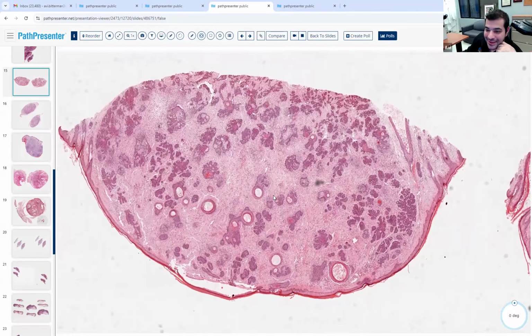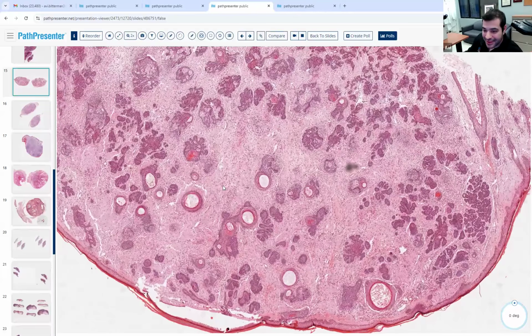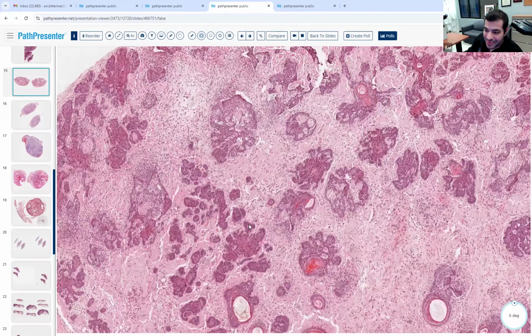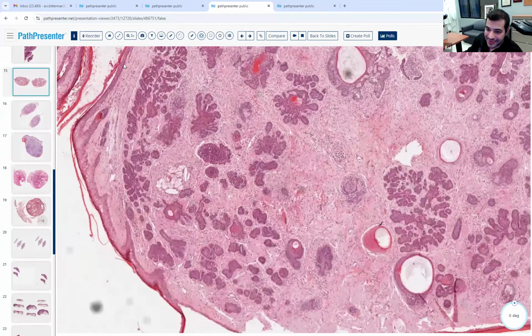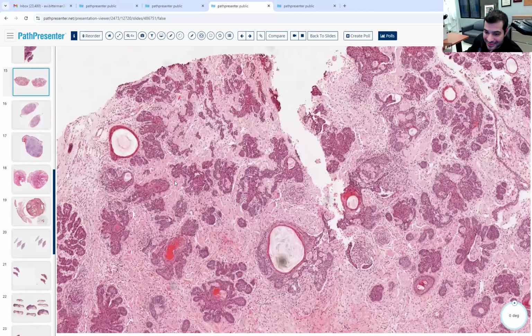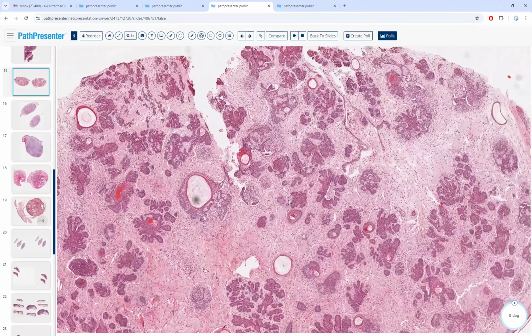What about this one, guys? Would you call this a paisley tie pattern? Well, I can see why you say not quite. I mean, this tumor has cysts and it's keratinizing, but it's more than just a paisley tie. Some of those areas kind of look like BCC, but then I was like, retraction.